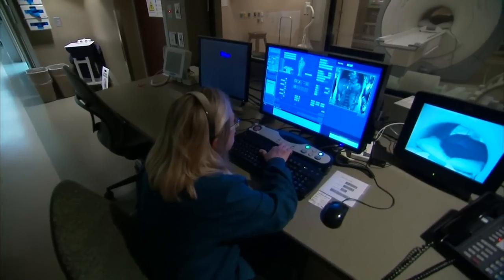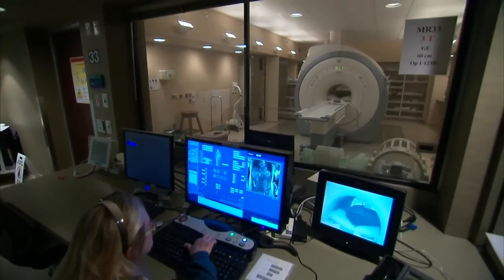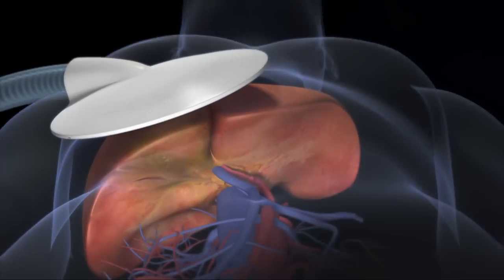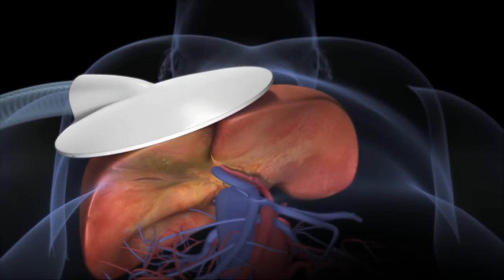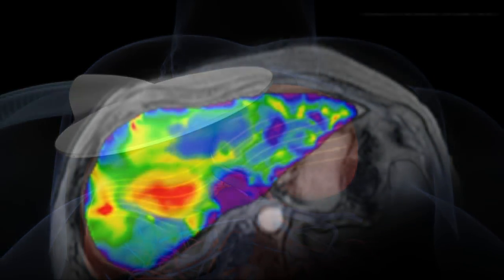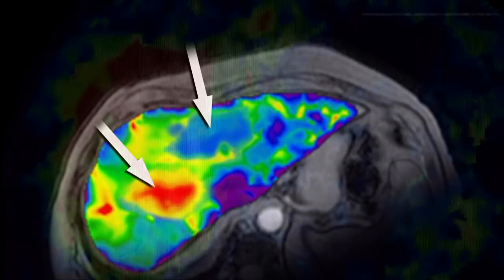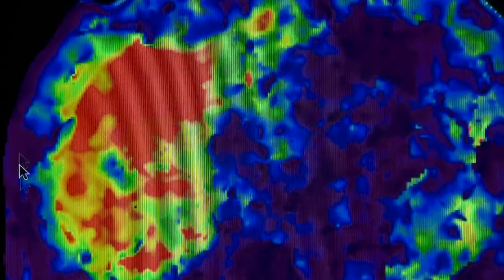The vibrations that are applied are not uncomfortable, and the risks associated with the exam are those associated with an MRI exam, which in general is a very safe procedure. A piece of equipment that looks like a little drum is placed on the patient's abdomen. The vibrations move through stiff tissue and supple tissue at different rates, and a computer analyzes the differences and shows what's healthy soft tissue and what's not. What the doctor sees is a color-coded image called an elastogram.